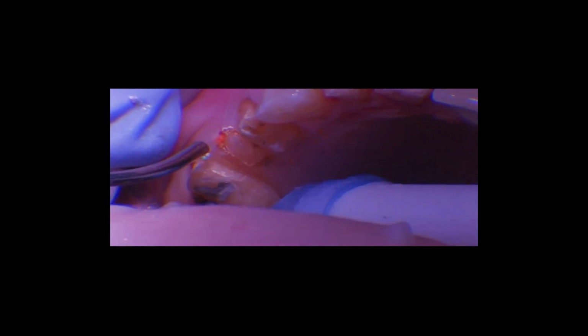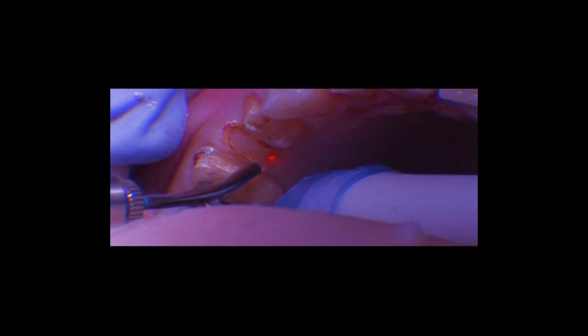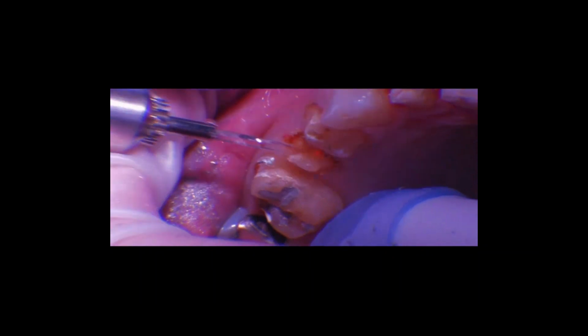So what you want to do first is outline. Number one, measure to see how deep you can go with your laser or your Pontic site and still maintain a 1 millimeter tissue thickness over top of the bone. But you want to outline your Pontic form, and what you want to consider is what that tooth would look like. So if it's a bicuspid and you were to amputate or cut that tooth off at the gum line, what is that root shape that you're left with? And that's your Pontic design. So it's going to be different on a central incisor versus a molar. So you want to create that trapezoid or triangular or oval type design and do your outline first.